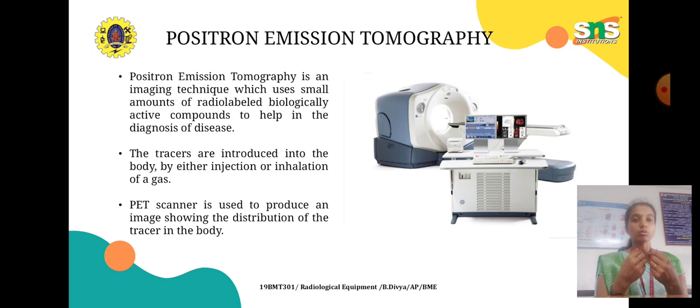By using those materials, we can see the images on the screen. The traces are introduced into the body by either injection or inhalation of a gas. By inhaling those things, the trace will reach the place which has been affected.